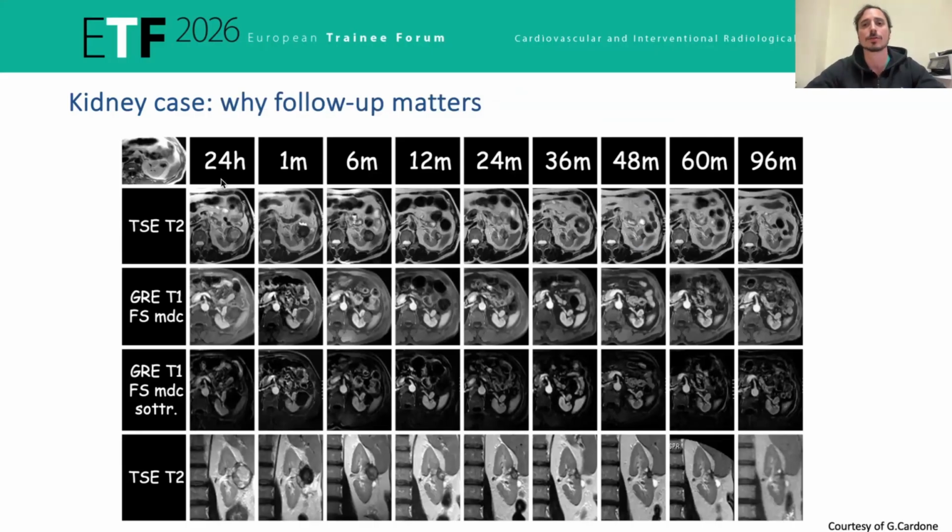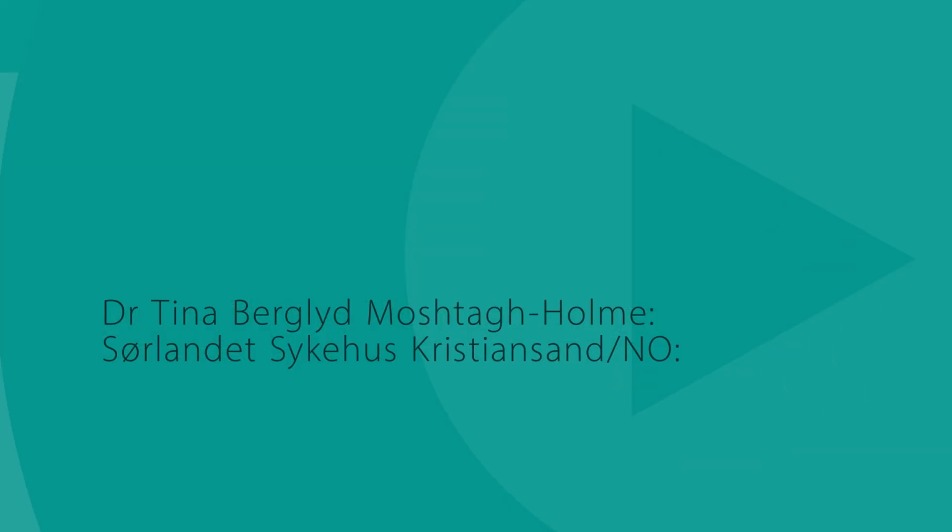This slide shows MRI follow-up after ablation from 24 hours up to long-term follow-up. Early after treatment, the ablation zone appears larger due to edema and inflammation, then progressively shrinks and becomes more defined.